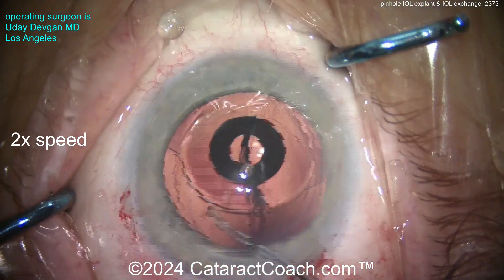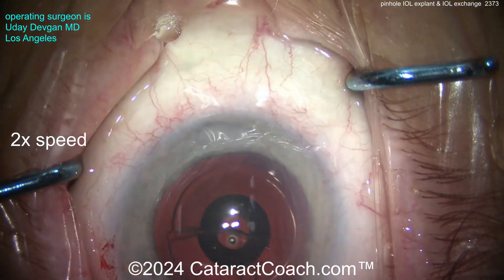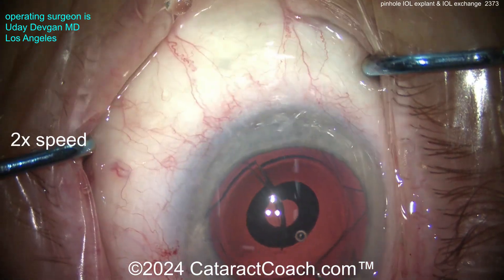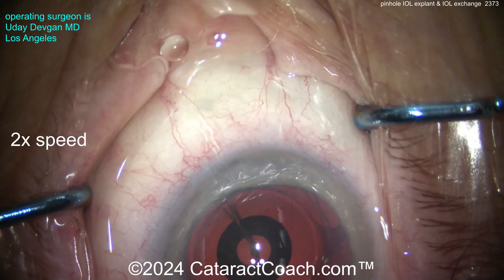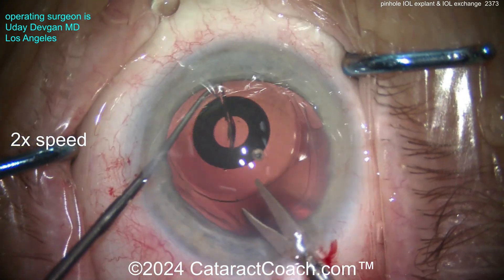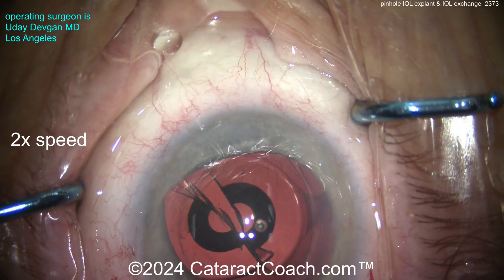A little more viscoelastic — it's always a good thing; viscoelastic is your friend here because we have to protect and save that posterior capsule. With this lens we're going to rotate it about 180 degrees in order to get the scissors to cut the other part. Cutting through again with a big layer of viscoelastic to protect the posterior capsule. Remember: if your scissors hit the posterior capsule, you could puncture it — you don't want that. Holding the lens with the Sinski hook and finishing the cut.